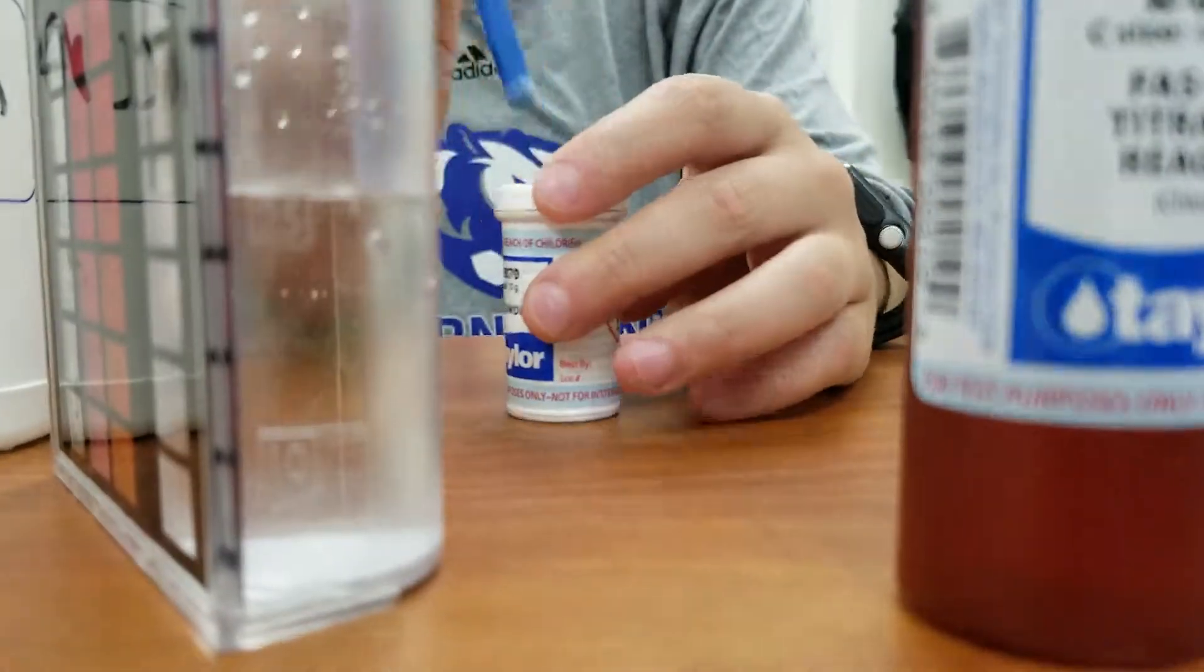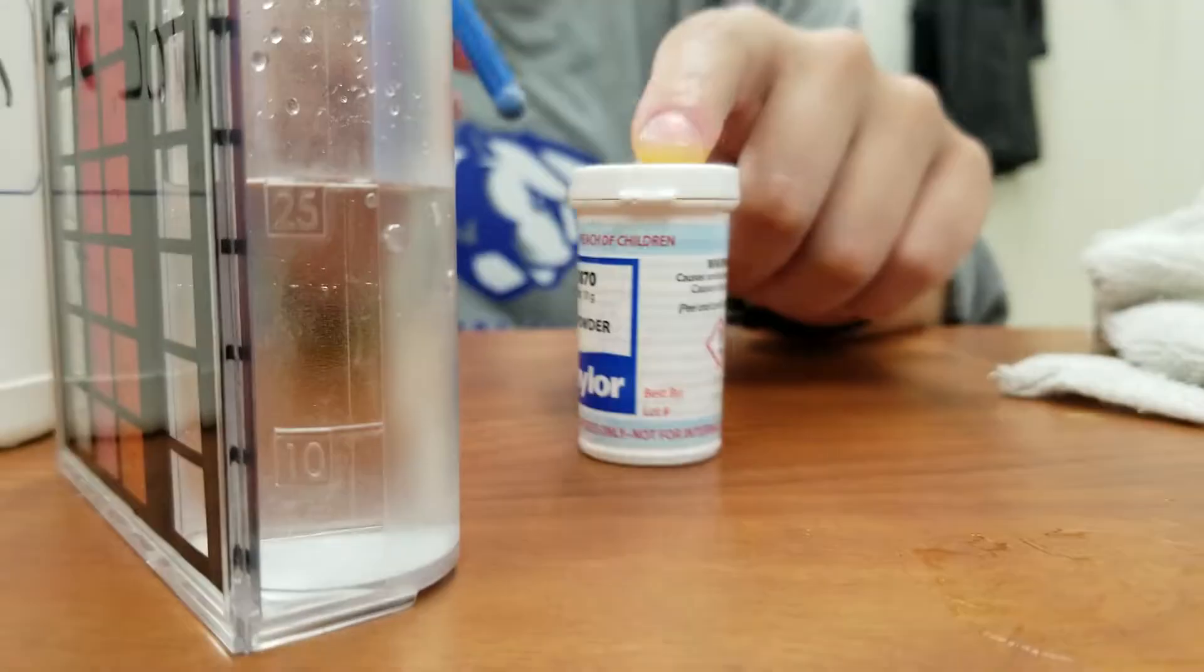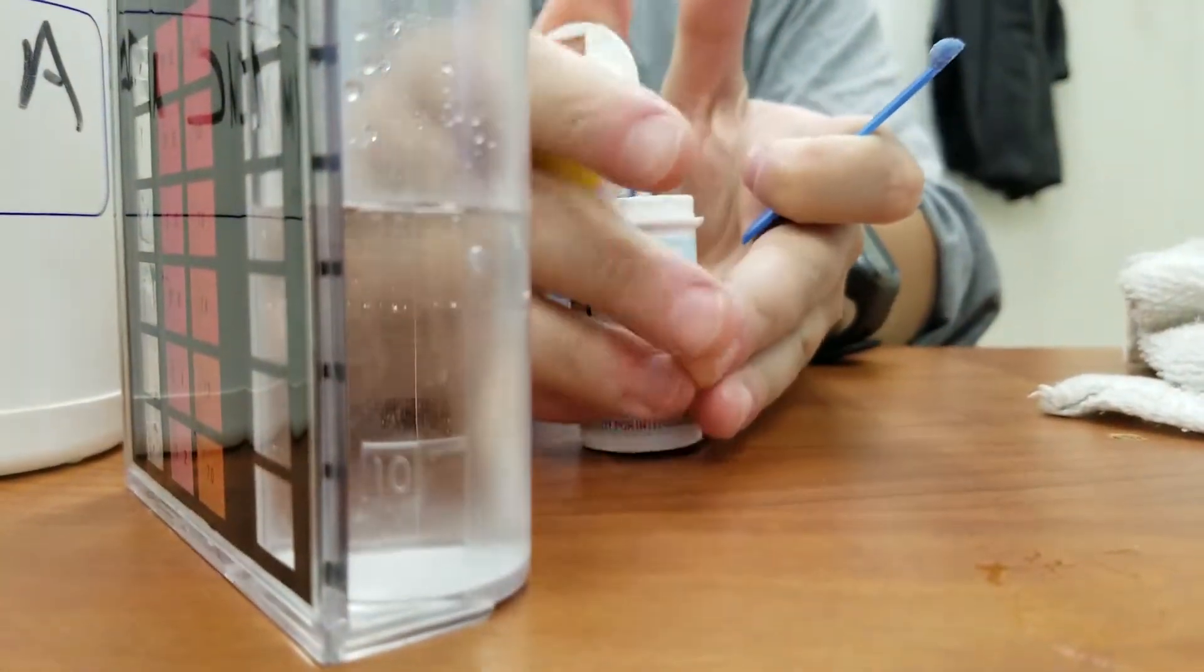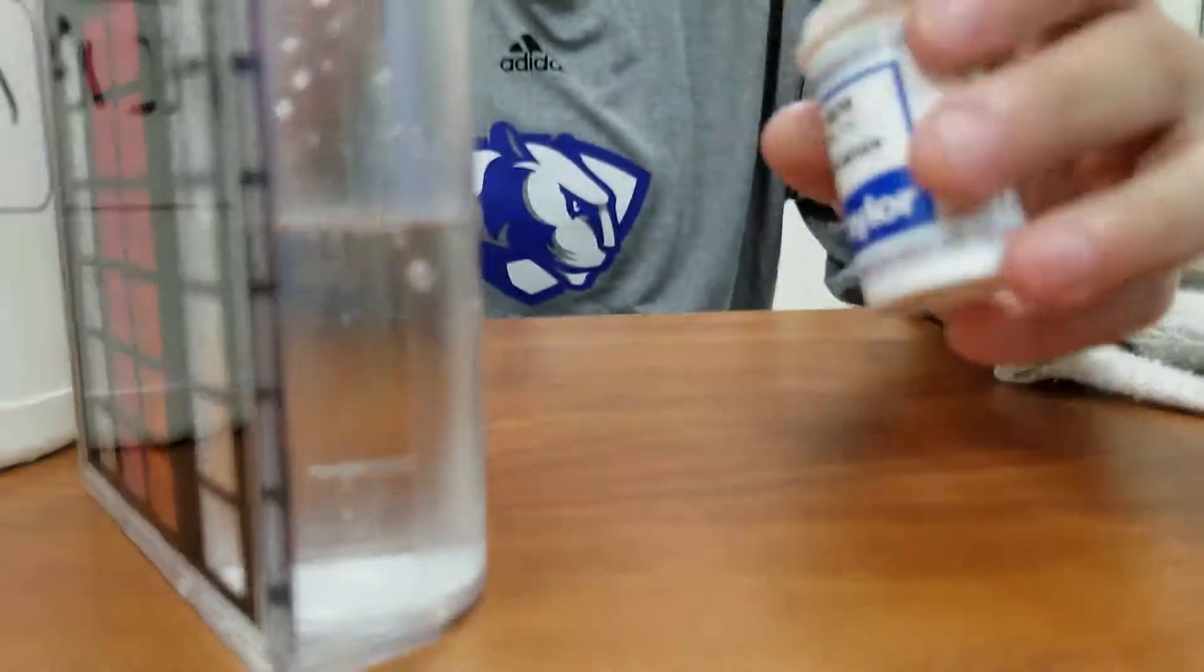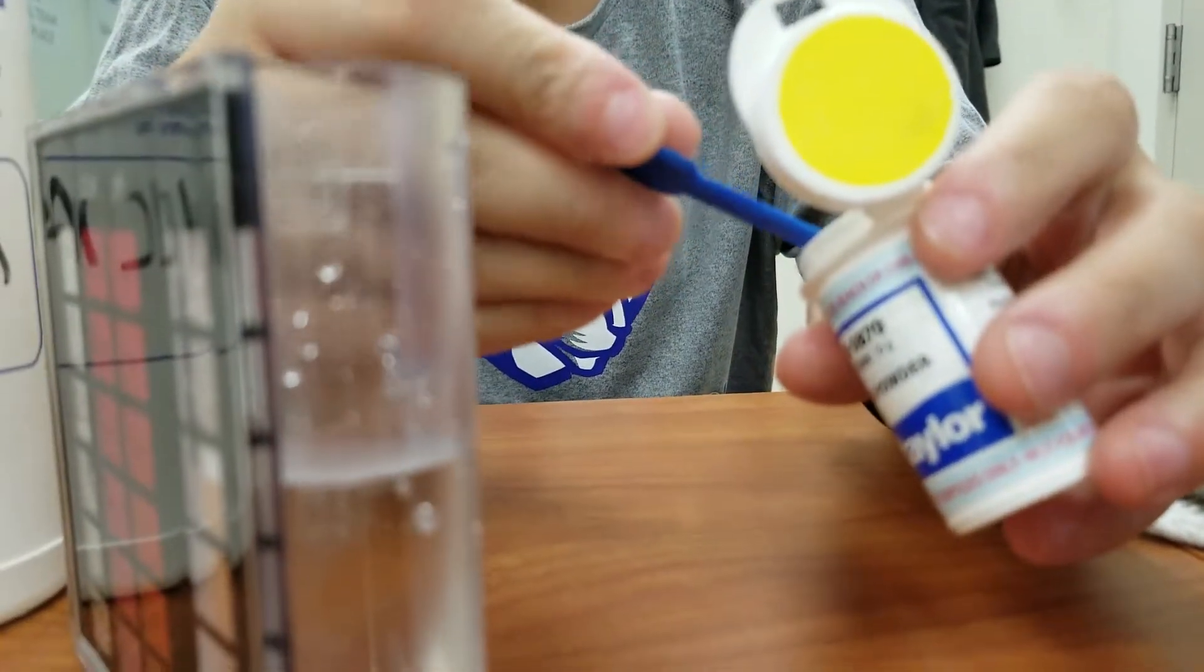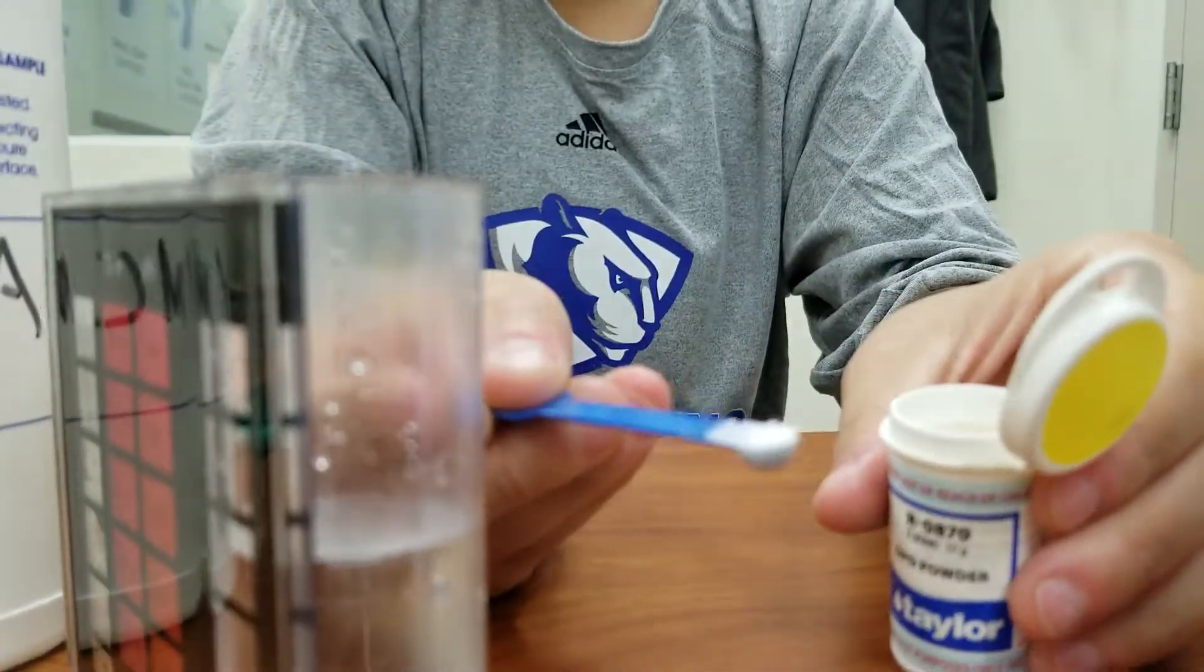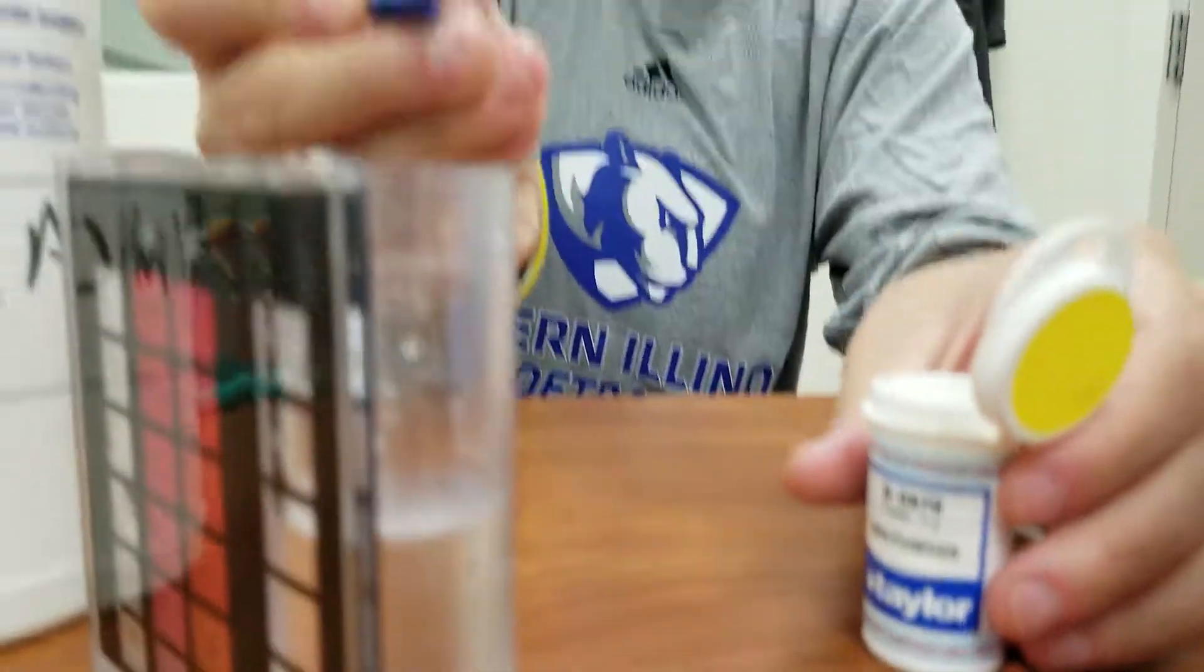Now we're going to take the powder agent, R0870, and we're going to take two scoops out of the circular tip of the handle here, just like that. Dump it in.